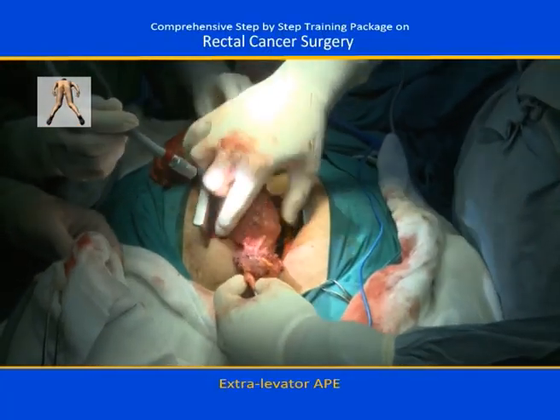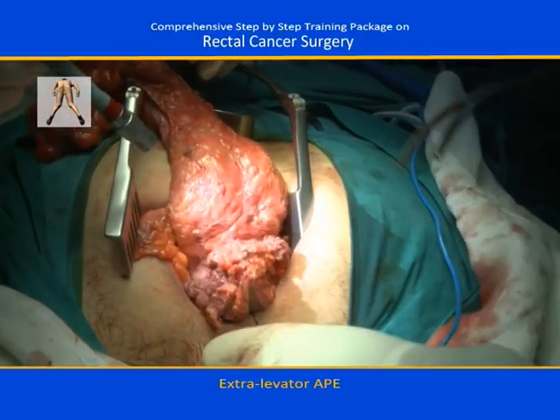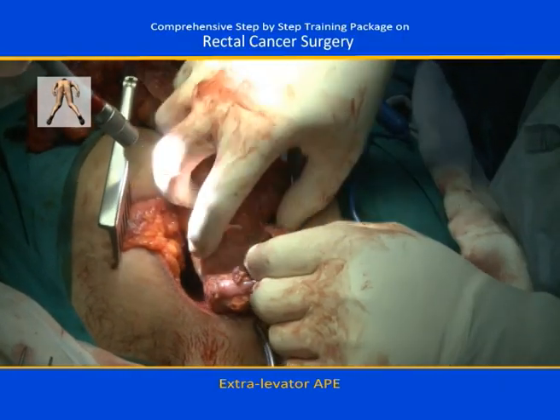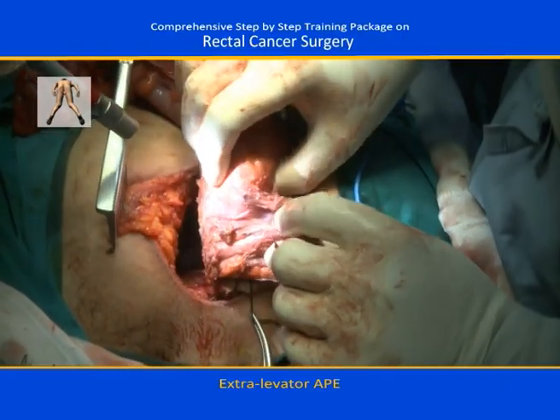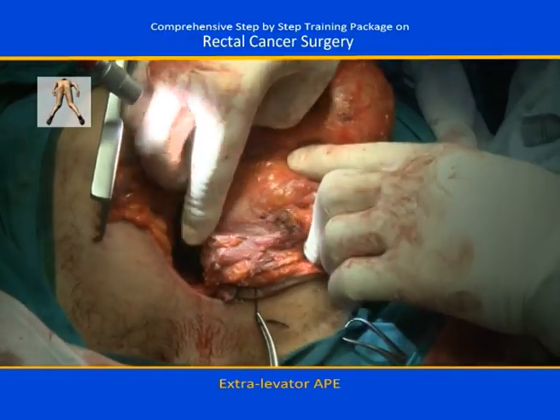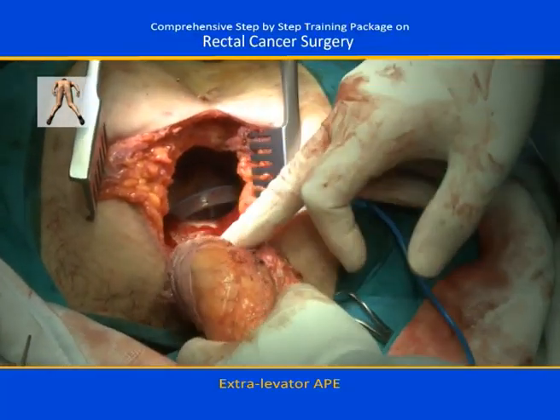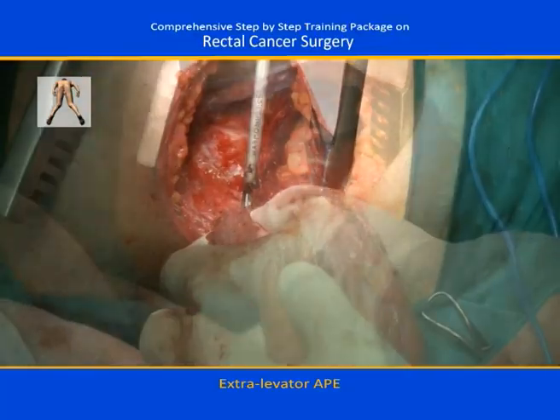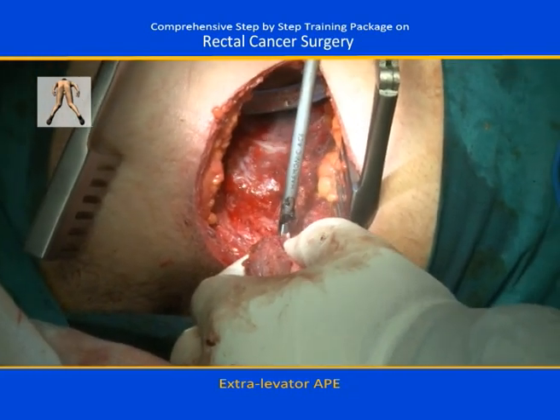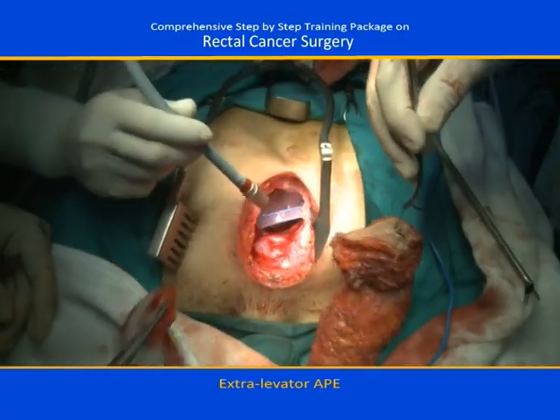Here we view the specimen. Note that the levator muscle is attached to the mesorectal fascia. Then, eventually, the specimen is extracted.